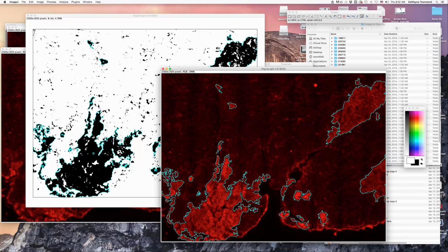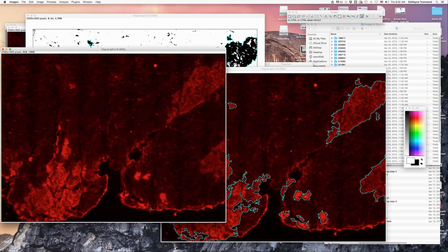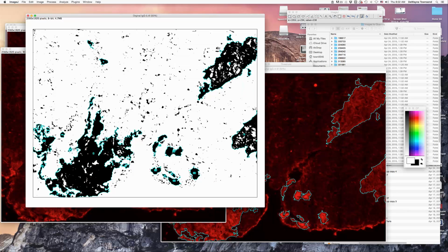We got rid of a lot of this stuff, so that's good. This is much better, we're doing okay here. Gotta decide about that little nubbin right here. So yeah, that's probably not a +5, so that's probably not worth spending too much effort on. Okay, so let's get rid of that because it's not positive. And then we have that positive area there, but then there's this little add-on, which again we don't think is real. Okay, so let's get rid of that, and there's this little tail coming up here, so we'll get rid of that. Okay, so this area I think is in pretty good shape.